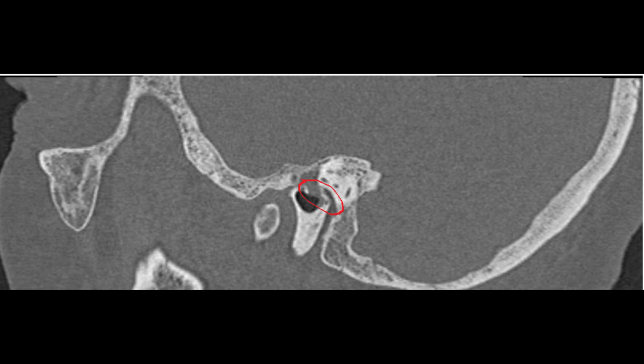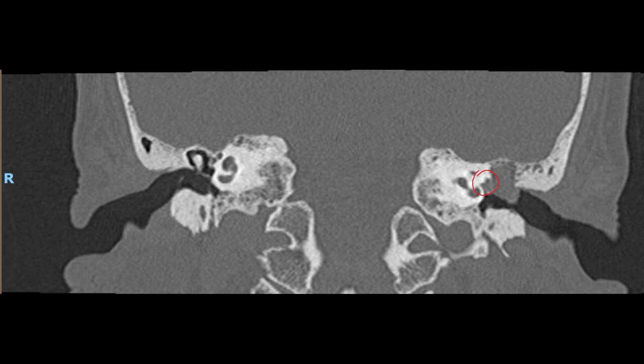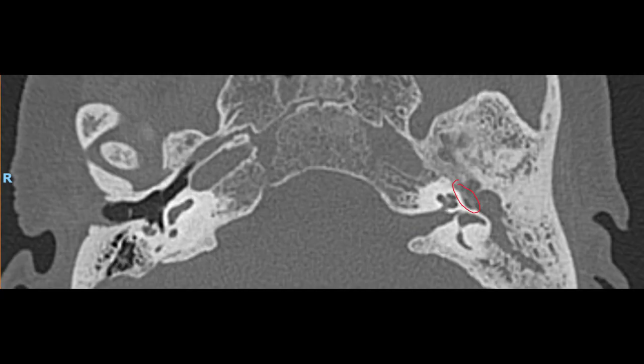This is the picture for the Attica cholesteatoma. As we can see from the CT scan in the axial view, coronal, and sagittal, the nerve has been exposed. The first picture is the sagittal, followed by the coronal cuts and the axial cuts, which show that the facial nerve has been exposed.